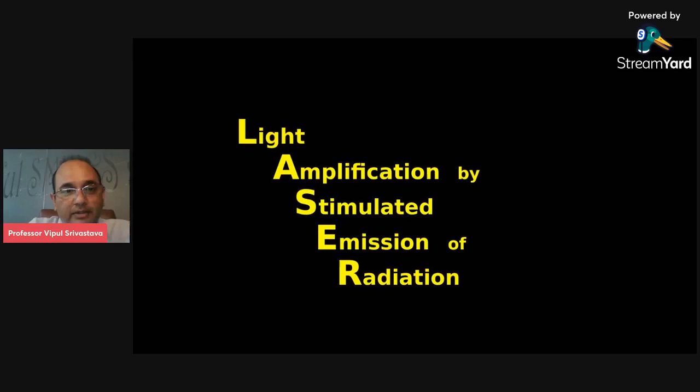Now we have so many lights. We have a common light, we have sunlight, and we have the light where I'm right now working. So this is also a type of light. So what is so different about laser light compared with common light? There are a few differences, three basic differences. I will not go into the detail because we are here just for the introduction part. So a little bit of laser physics here. What are the different types of laser light?